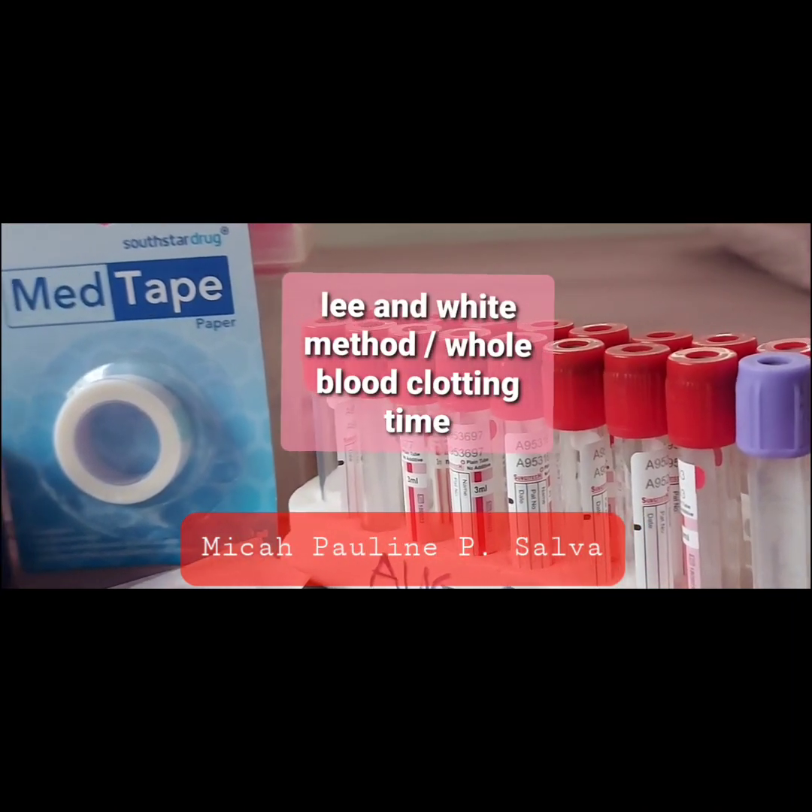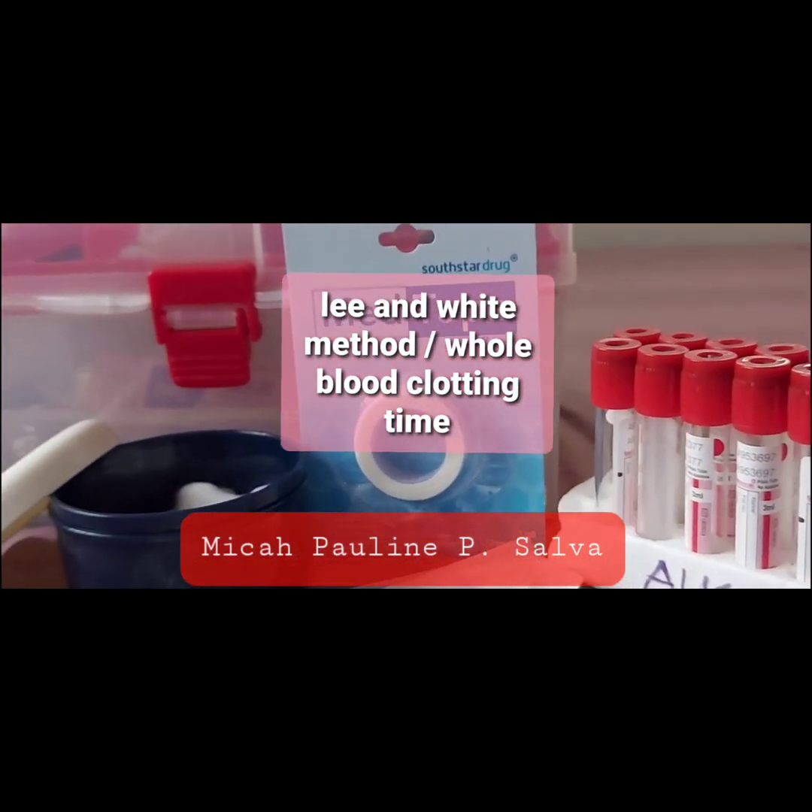Lee and White's method, or whole blood clotting time.